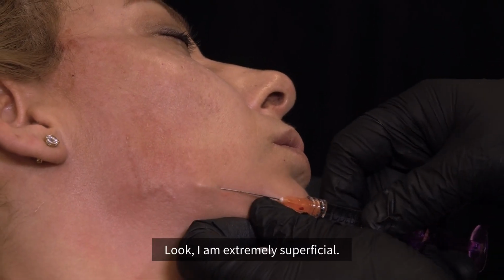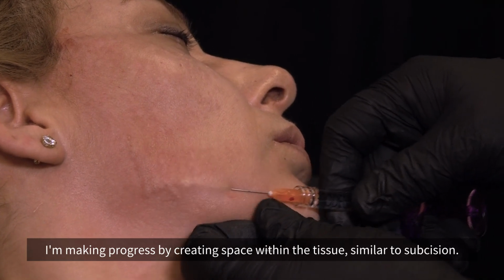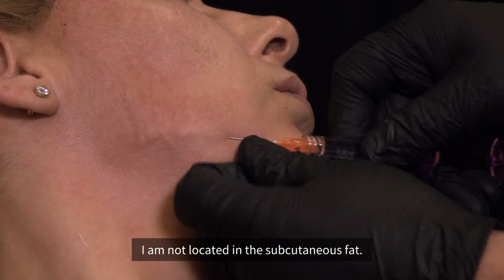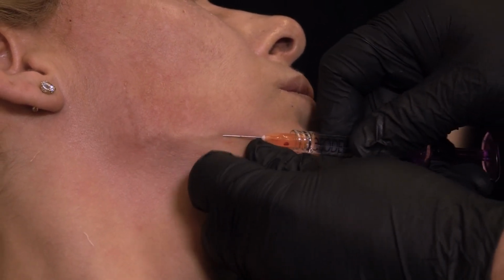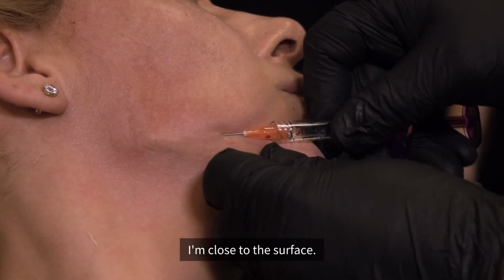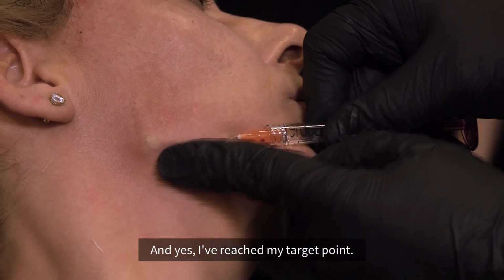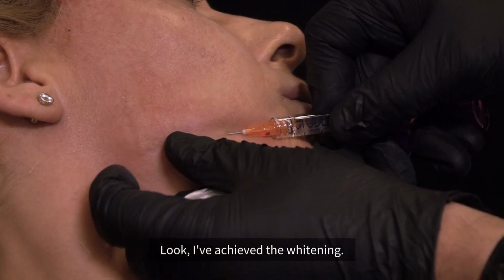Look, I'm extremely superficial. I'm making progress by creating space within the tissue, similar to subcision. I'm not located in the subcutaneous fat. I'm close to the surface. I moved further ahead, and yes, I've reached my target point. Look, I've achieved the whitening.